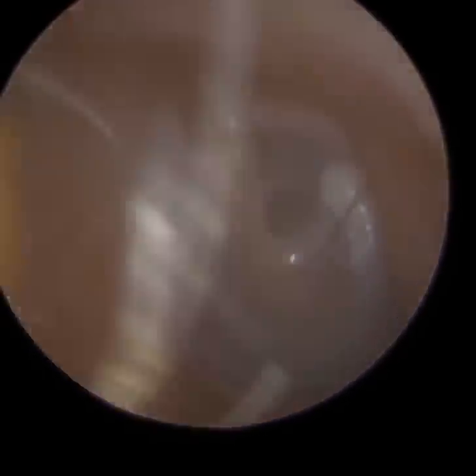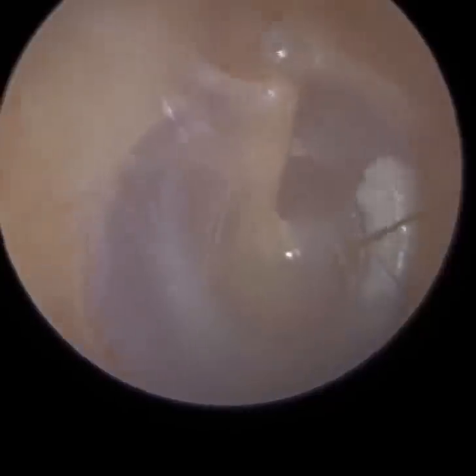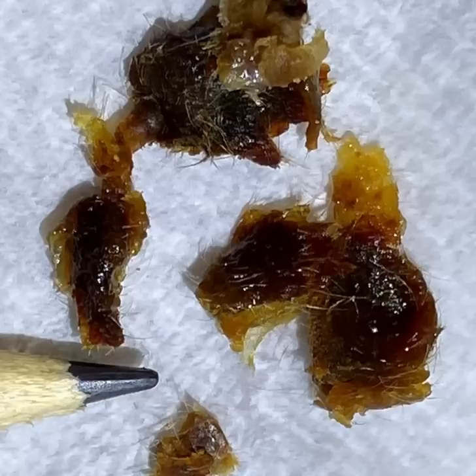There's the attic region I'm focusing on at the top — you can see the scar tissue to the right. We're just going to mop up some dead skin laterally on the anterior and posterior canal walls. Because we're near the entrance, we call that the lateral aspect. And you're going to see a still image of the debris I removed — all the wax and keratin from both ears. Well, I hope you enjoyed that video, guys.